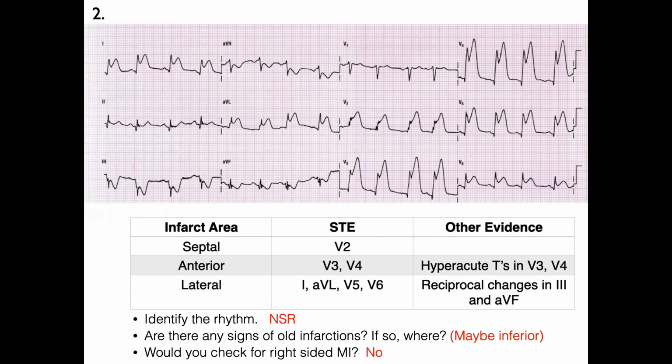Identify the rhythm. Again, as paramedics, we don't do it in the field, but I want you to practice getting the rhythm from just a 12 lead with no rhythm strip on the bottom. The only reason I'm asking you to do that is you may be asked to do it in the National Registry. I don't know that for sure, but it's just good practice. And that's pretty easy, it's just normal sinus rhythm, okay? You can figure that out.